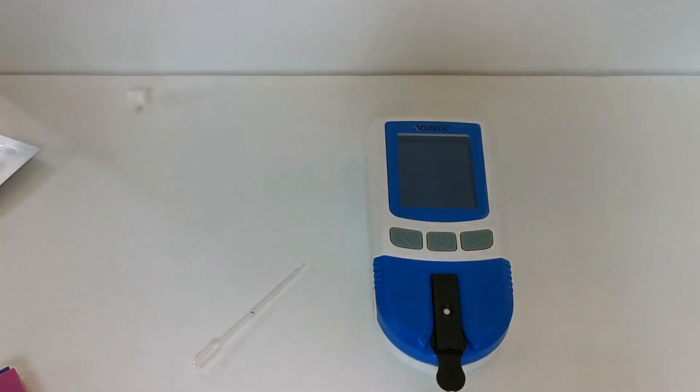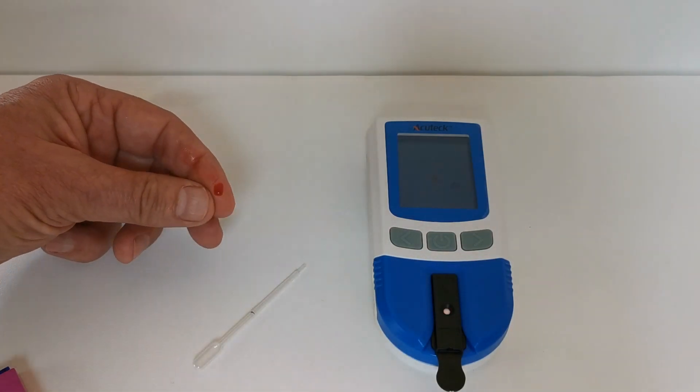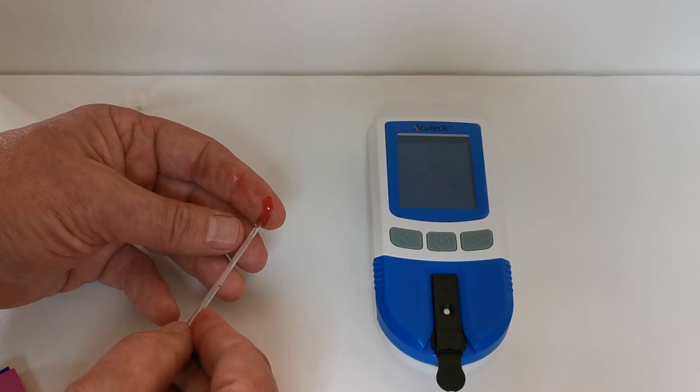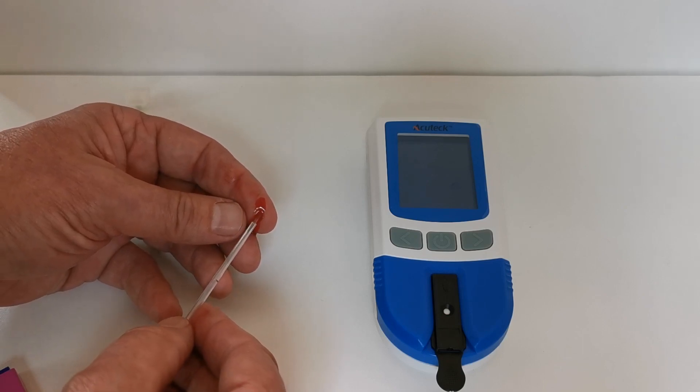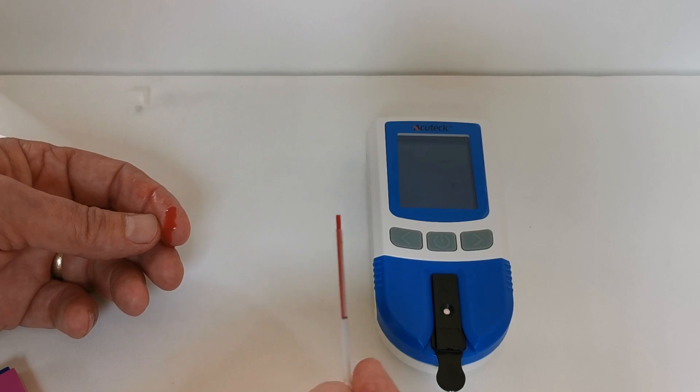You wipe the first droplet away and then squeeze the finger to allow a good second droplet to form. Then using the pipette, just put it sideways and allow it to naturally fill. You can see that it does so, and as soon as it reaches that black mark it should stop filling.